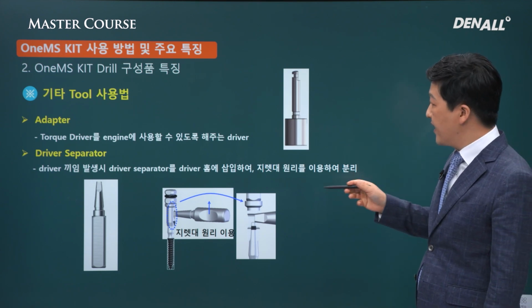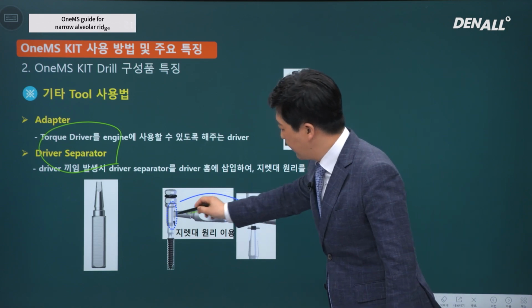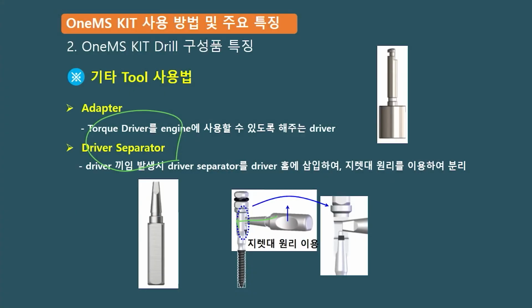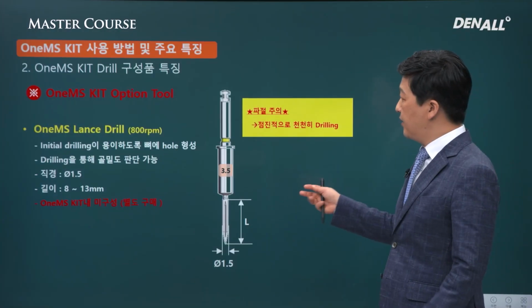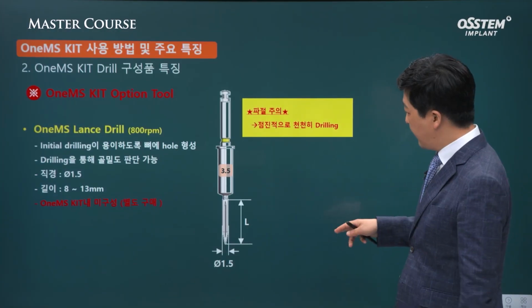In such cases, you can use a drive separator. Put it between the adapter, and if you lift it slightly, mounted driver falls out, so it's a very useful tool. For placing MS implant, when you do initial drilling, you need to use lance drill with a sharp tip.